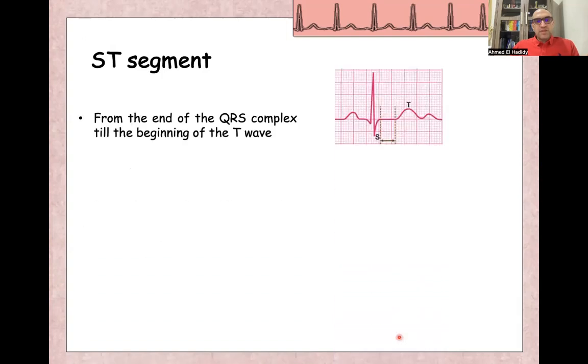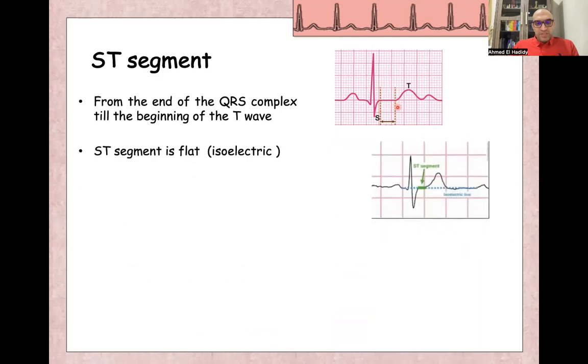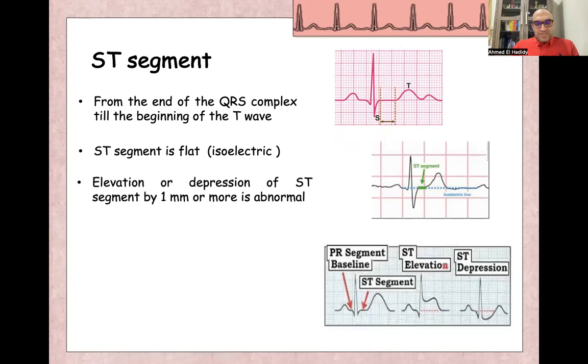ST segment starts after the end of the QRS complex, after the end of S wave, till the beginning of T wave. Usually, or normally, ST segment is isoelectric or flat when compared to PR segment here before the QRS complex. So it will be isoelectric in the same horizontal line as PR segment. Any ST segment elevation or ST segment depression more than one millimeter or one small square is significant.